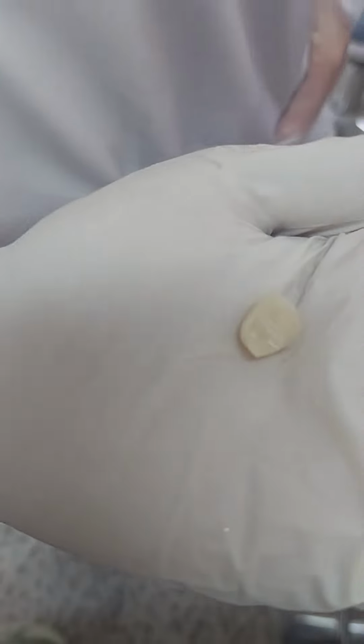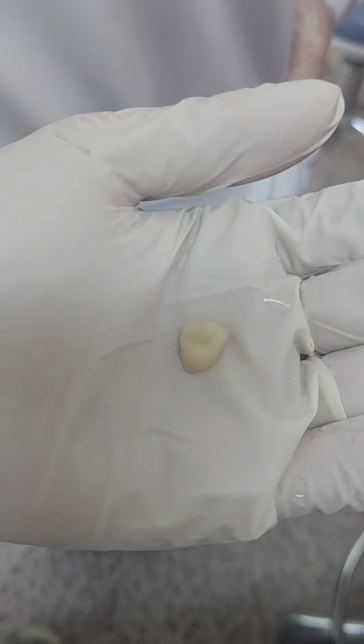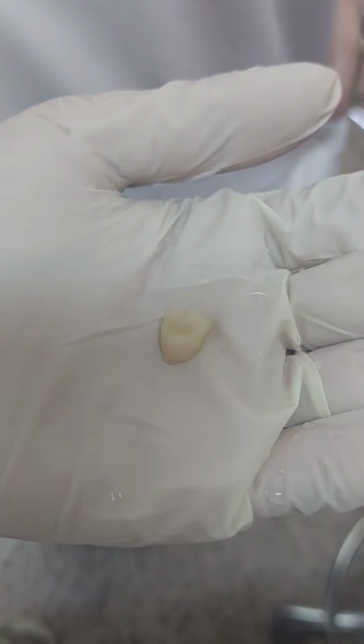So the temporary material, go back to the occlusal surface. Notice that the temporary material filled in the occlusal surface. But where is the space for the prepared tooth itself? So that means you have not seated it at all. Oh. It didn't, it just touched it, barely.